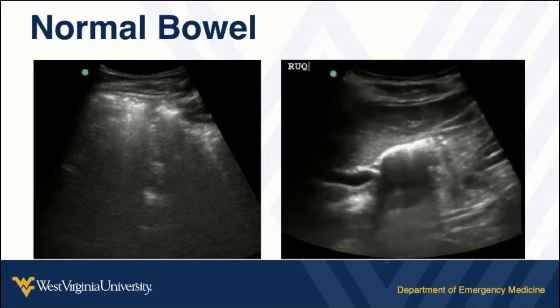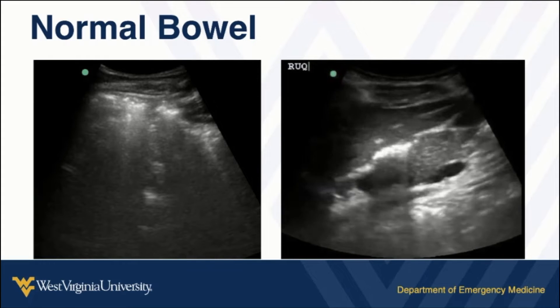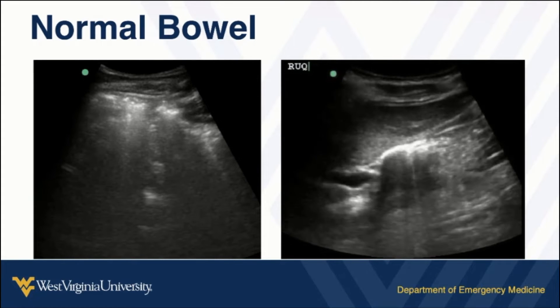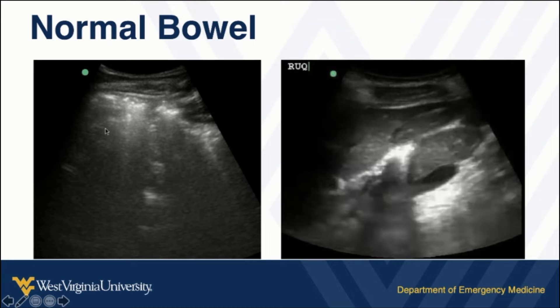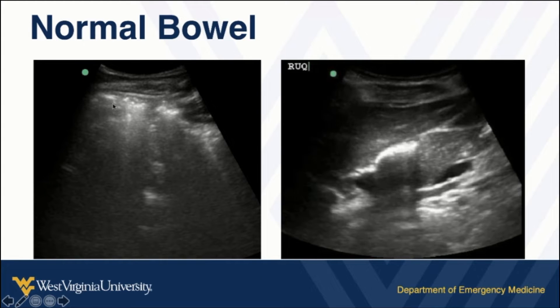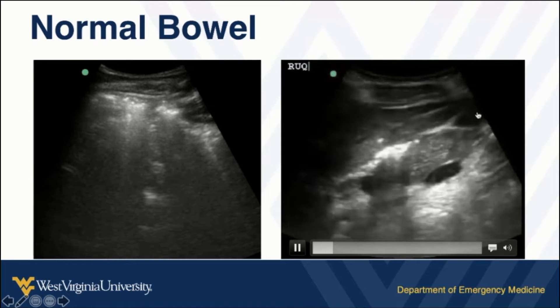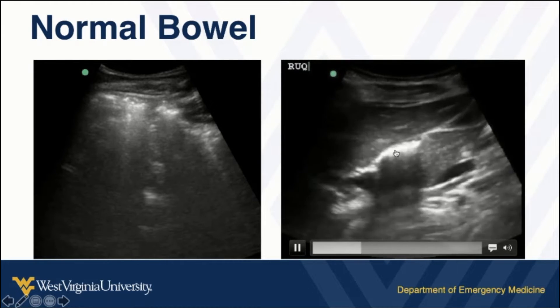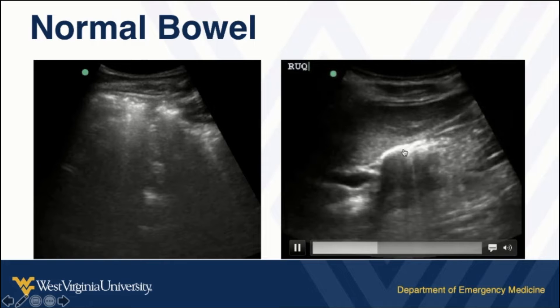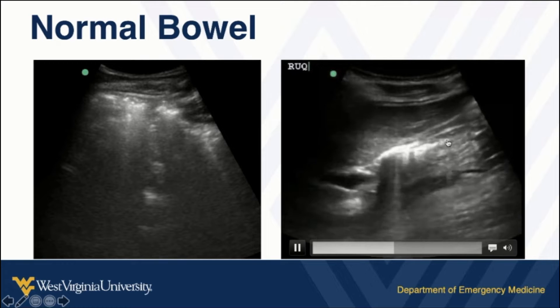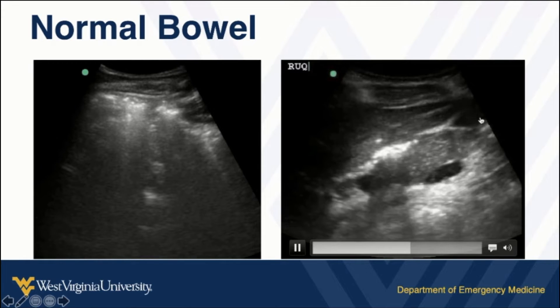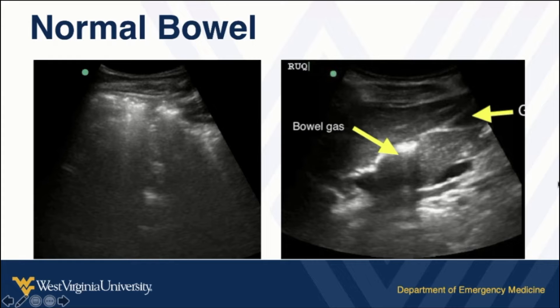Just a few things about what normal findings may look like. Normal bowel is going to be filled with air, so you're going to get this air signature where you get these bright white little bubbles and these streaky artifacts. Over here you can see this is bowel gas — that's air with streaky artifact. This is the gallbladder up here, so don't mistake this for a gallbladder full of stones, because that's an air signature with those streaky artifacts, separately identified from the gallbladder.